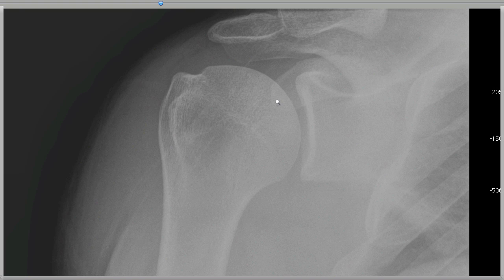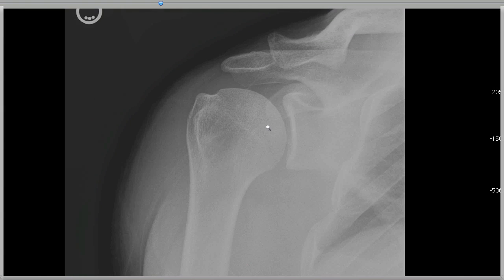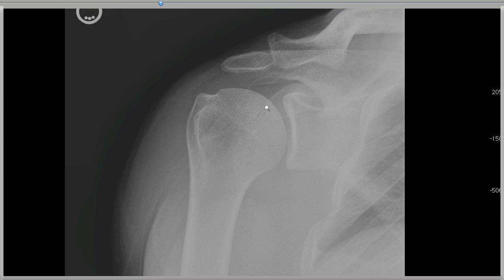The AC joint itself is not as well seen on a Grashey view, but you can see the distal clavicle lining up with the acromion. The coracoid process, remember, comes off the scapula and projects out — in this case projecting slightly over the humeral head.